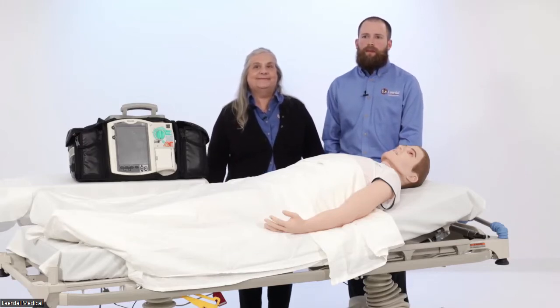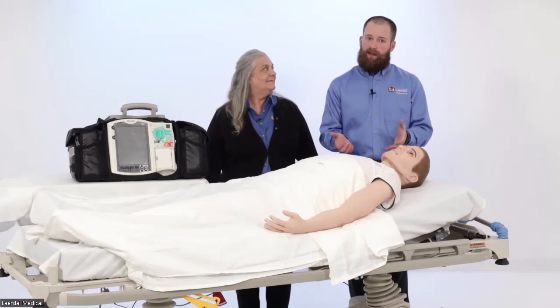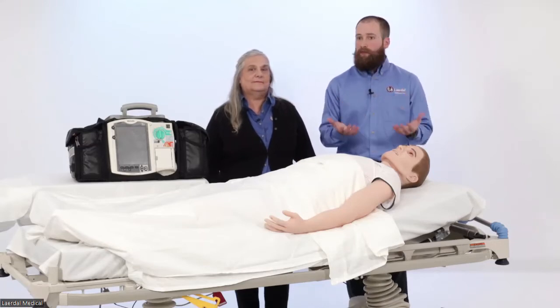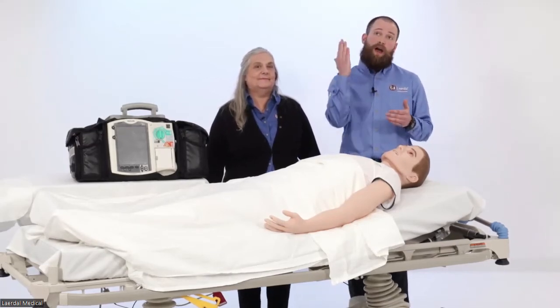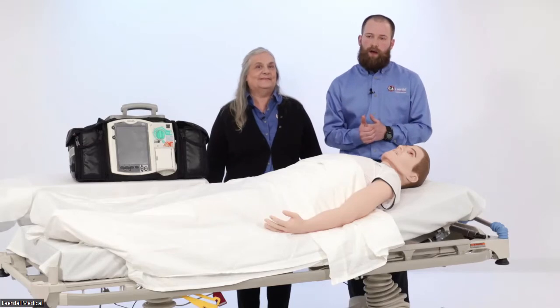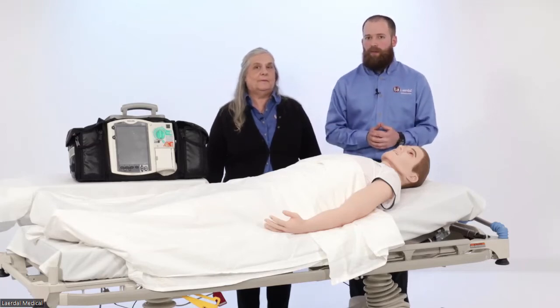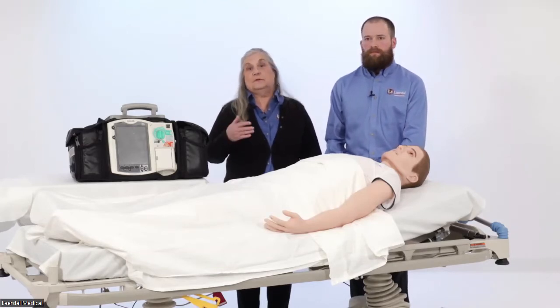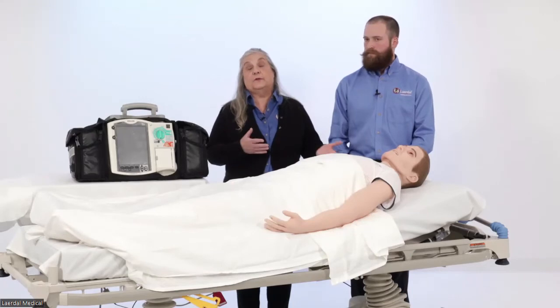Okay, let's see. What else did we have come up? Oh, here's a good one. Is there a range on the Wi-Fi dongle? So I can take that one, actually. When they did the testing on these new Wi-Fi dongles, just to double back on that network services piece that we talked about, as we know, a lot of sim labs can be in basements or through multiple walls. So is it going to connect to a Wi-Fi that's in a different room? We did test a lot of those different scenarios. I don't have a specific range for you, but we did a lot of testing through very thick walls and multiple rooms across a large sim lab. So the connectivity we found to be much better and much more stable than that internal router. And one of the questions was involved with routers. Somebody is used to using an external router. You answered that. You can still use your external router with the mannequin.